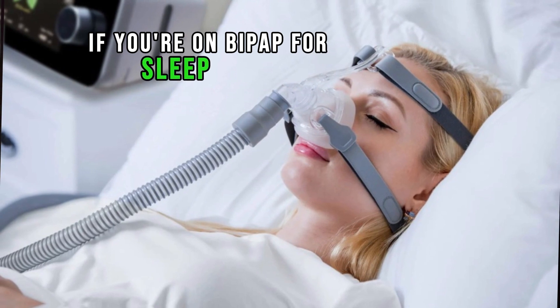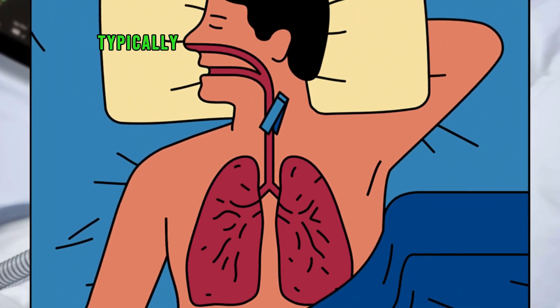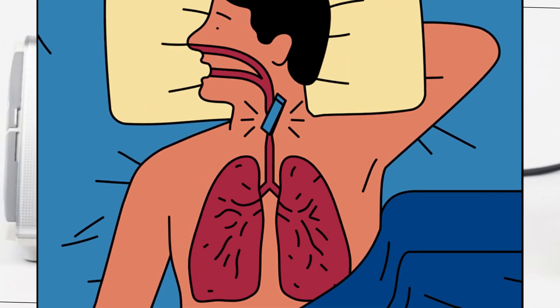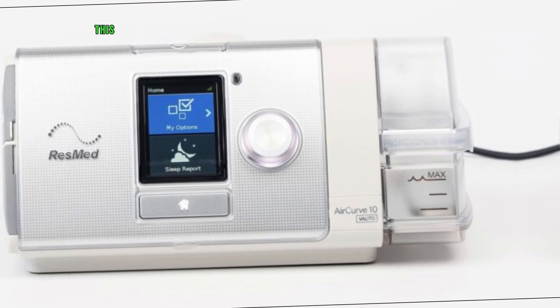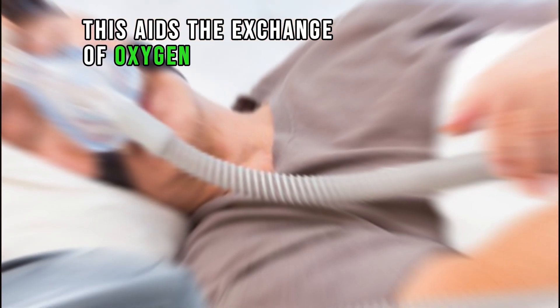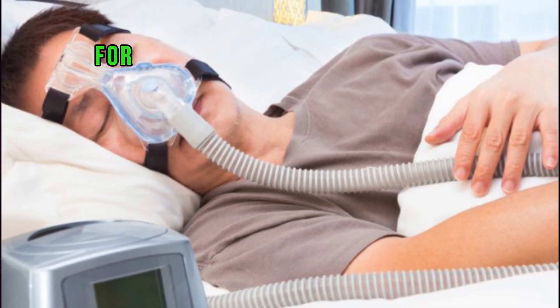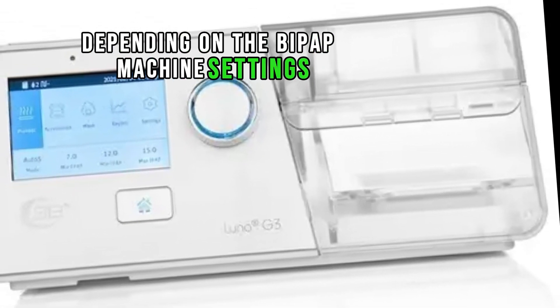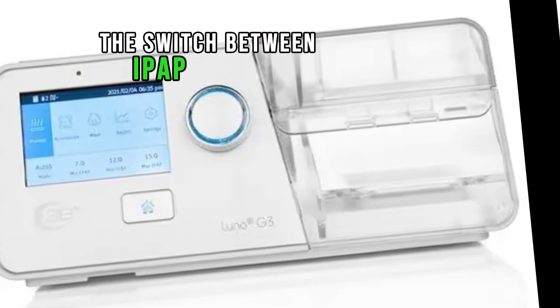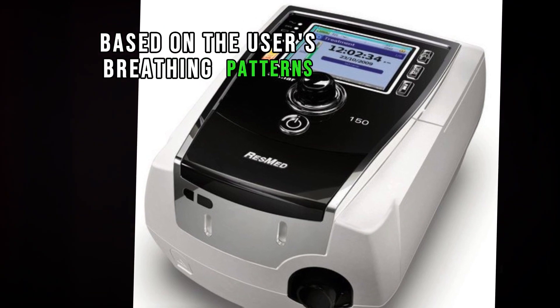If you're on BiPAP for sleep apnea, you can use it at night indefinitely. Typically, you'll use a BiPAP machine at night to help keep your airways open while sleeping. This aids the exchange of oxygen with carbon dioxide, making it easier to breathe. For people with COPD, this means less labored breathing during the night. Depending on the BiPAP machine settings, the switch between IPAP and EPAP may be timed or automatically based on the user's breathing patterns.